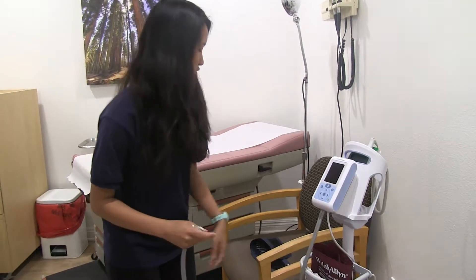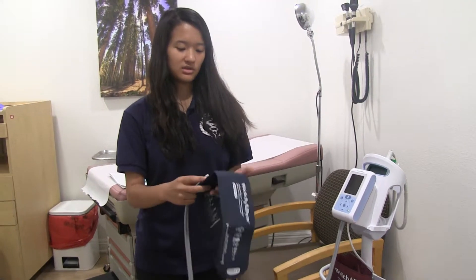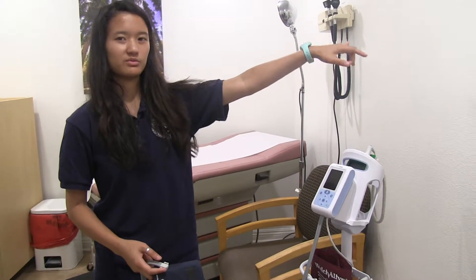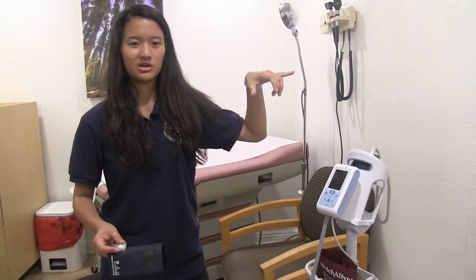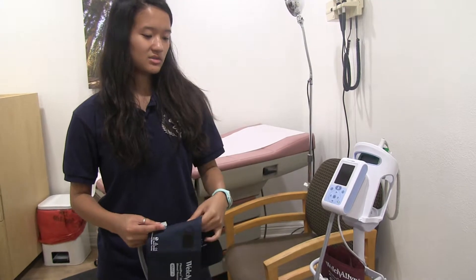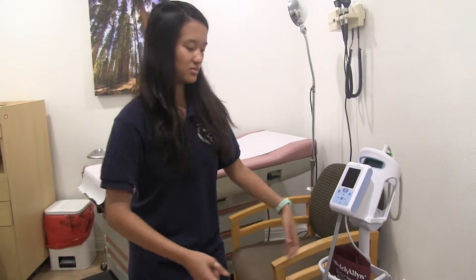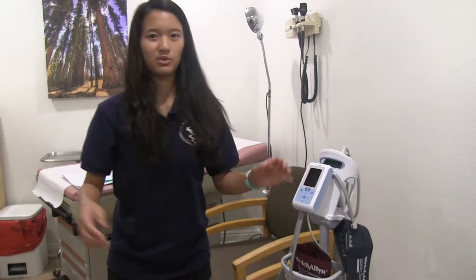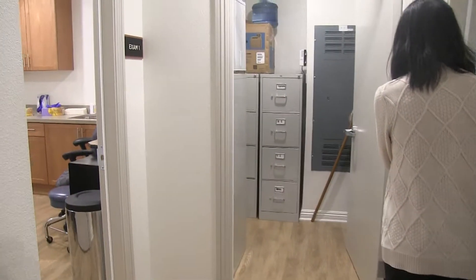And then, usually with this vitals machine, we roll it around between room one and room two depending on what room is free. So if someone's going to be seen in room two, you move the vitals machine outside to room one. But if both rooms are occupied, you're going to move it to that closet room over there.